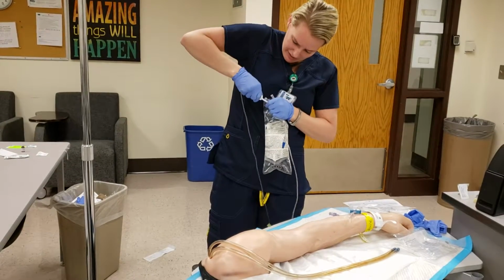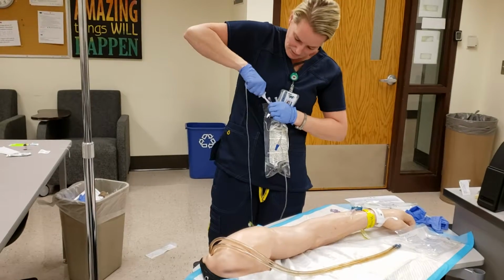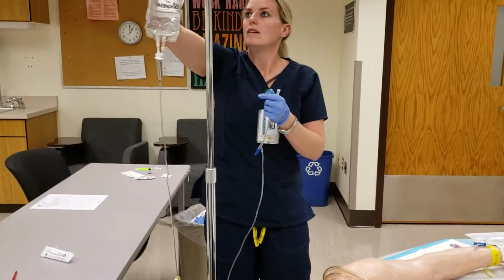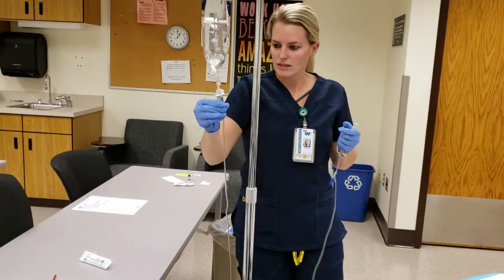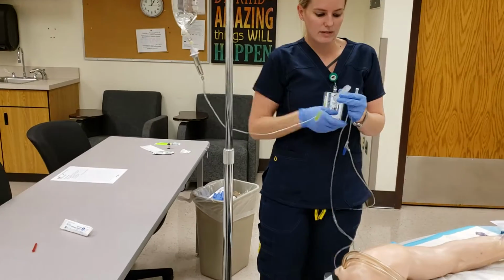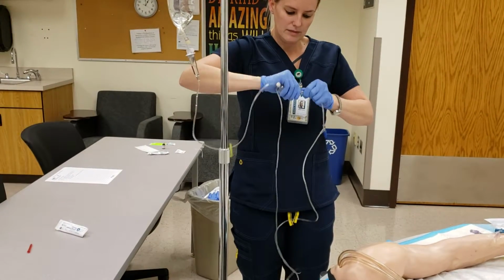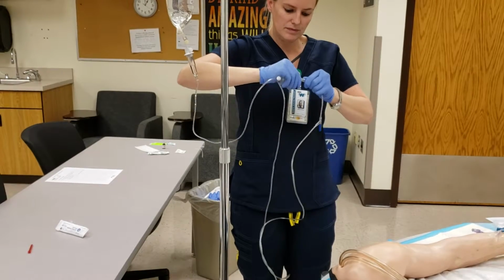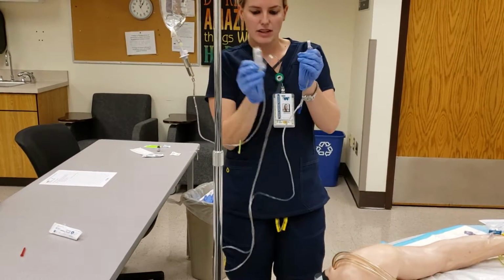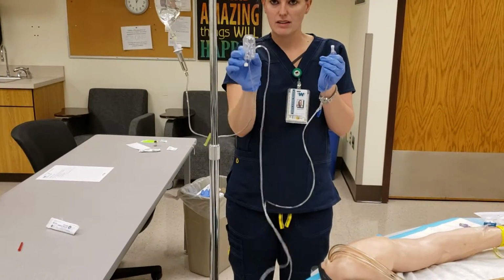Spike my bag. Loosen the cap here. And I'm going to start with my disc inverted.